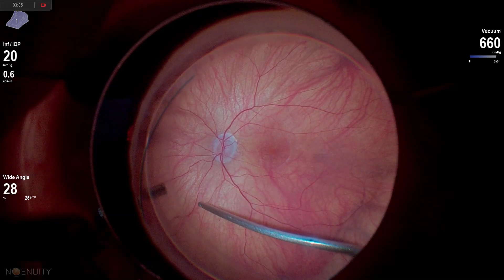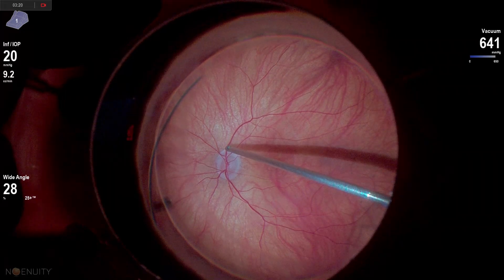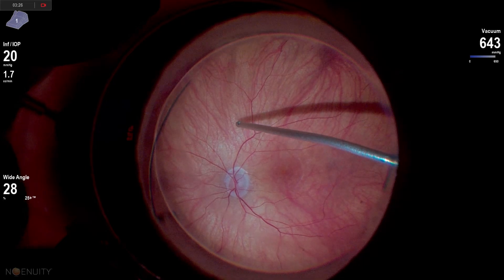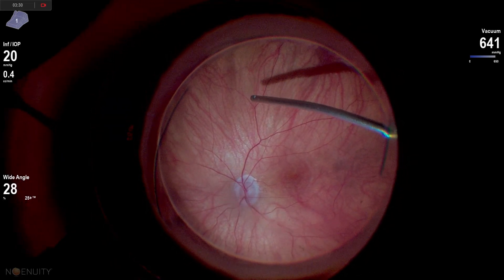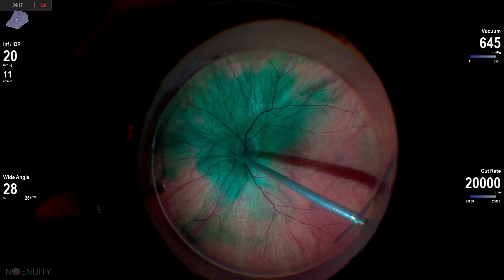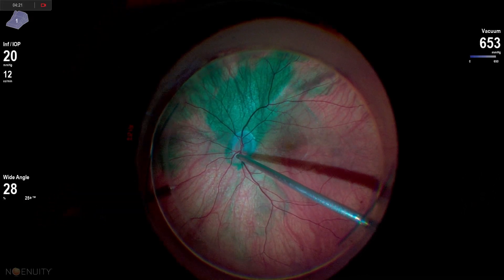I had to really go back to the fundamentals. One of the things I was taught early on in my fellowship is this up-and-out maneuver. Dr. Tim Murray really instilled great fundamentals in us. This is one of the things he taught us — you kind of go along the eye wall and try to shear the vitreous off of the optic nerve head, kind of an up-and-out motion.